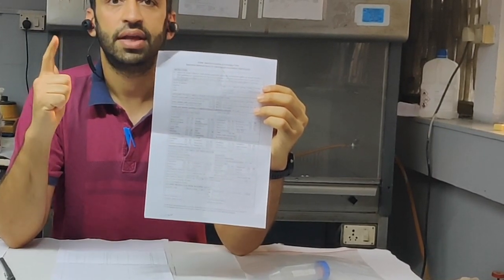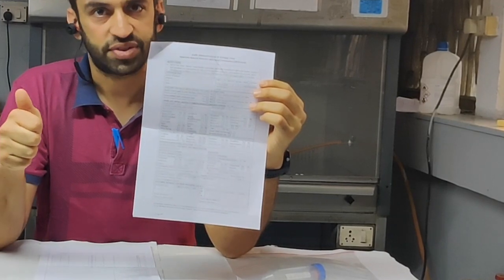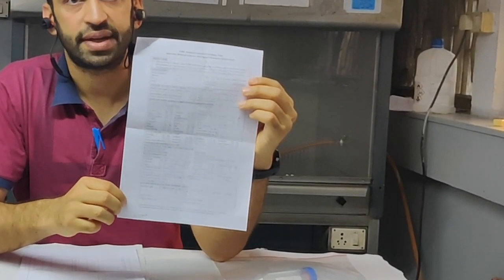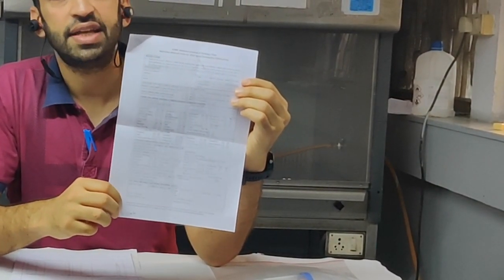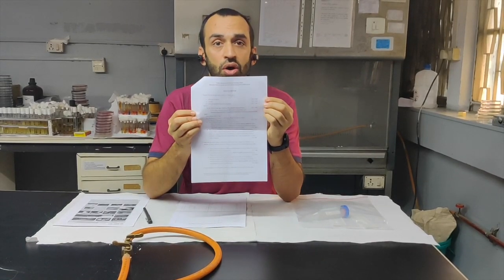That is the specimen which has been collected, the date of the collection of the specimen, and also the label number of the specimen. After doing that, you have to give your own details, that is name, your designation and email ID, which will be provided by Microbiology Lab. If you have any doubt while you are filling the form, you have to refer to the second page of this form.